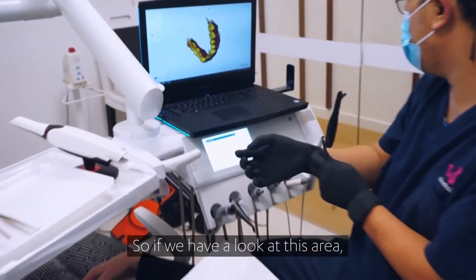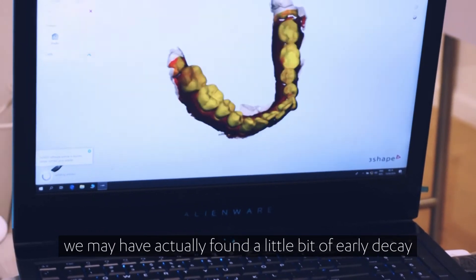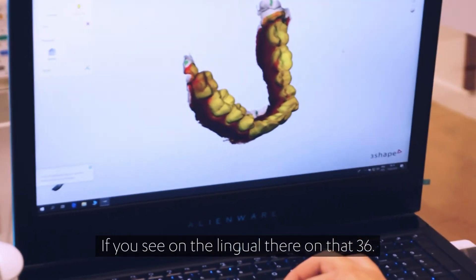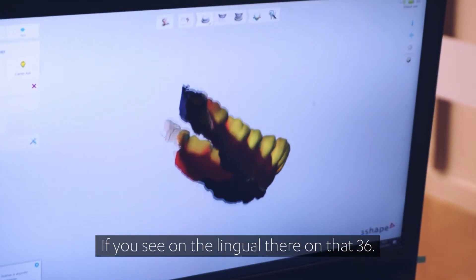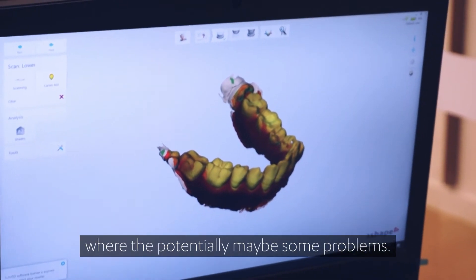If we have a look at this area, we may have actually found a little bit of early decay or leakage of a restoration. You can just see on the lingual there of that 3-6. We're going to try and take an HD photo of that, where potentially there may be some problems.